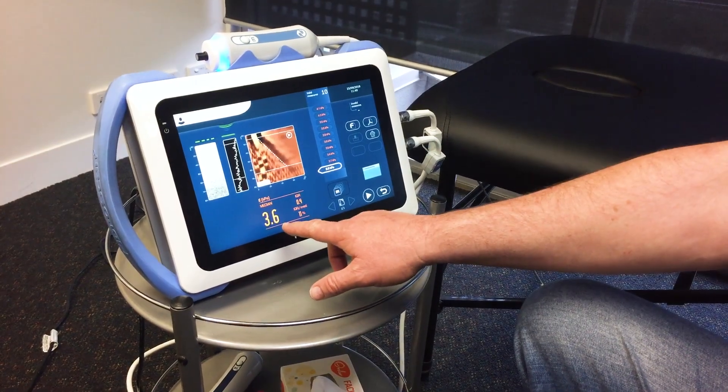The FibroScan results will show you how much scarring you've got on the liver and that will tell you the level of fibrosis or cirrhosis that you have on the liver.